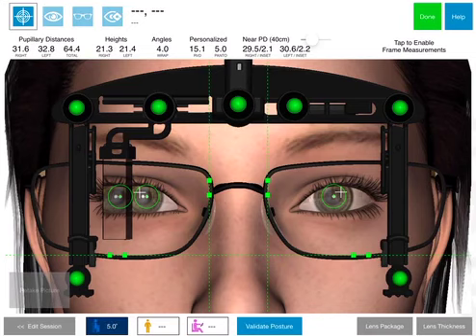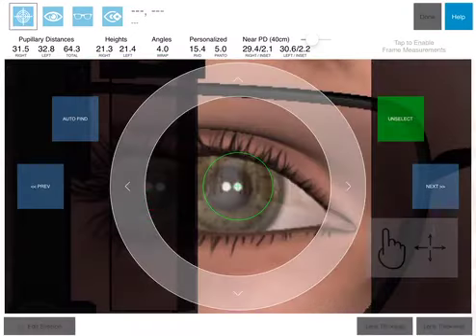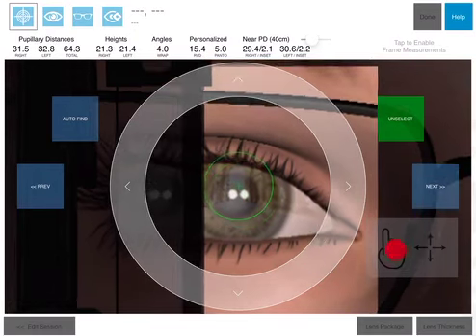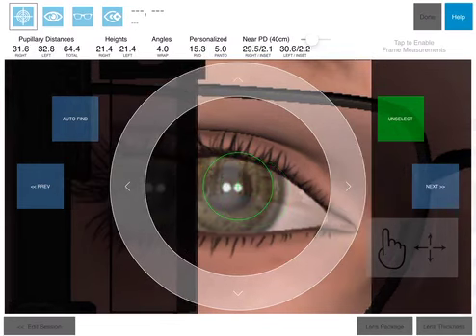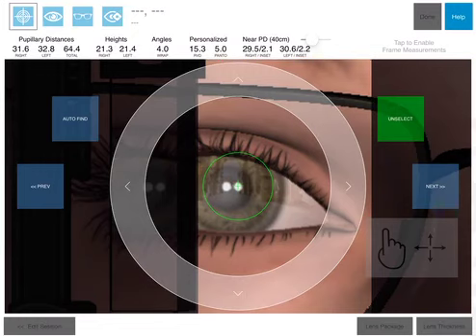If it's necessary to adjust the position of a displaced marker, begin by selecting the marker by either touching the two square line anchors or the pupil marker crosshairs. Once a marker is selected, drag outside of the directional ring to make large position adjustments. Alternatively, tap anywhere inside the ring to move the marker to that specific location. Use the directional circle arrows to make fine adjustments.